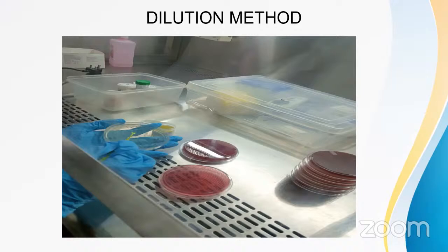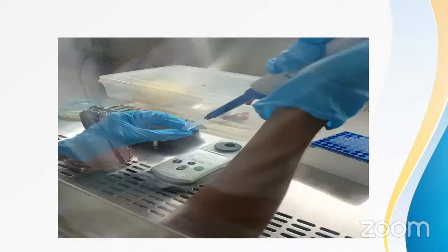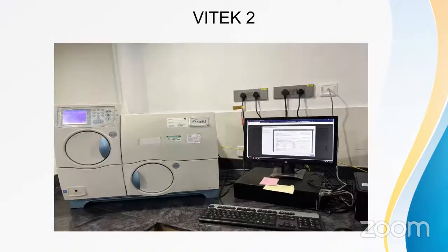I'm showing how it's done in the lab. Initially, from agar plates, they take the inoculum sample with a loop and put it in diluent tubes, mix it well, and put it in a densitometer to get the required density. Then they add it to the microtiter well plates, put them in the Vitek machine, and leave it for 18 to 24 hours, when we get the report on the screen.